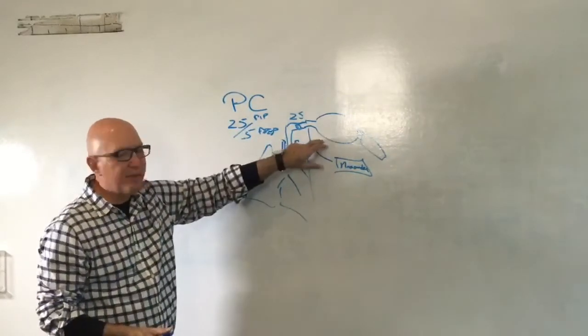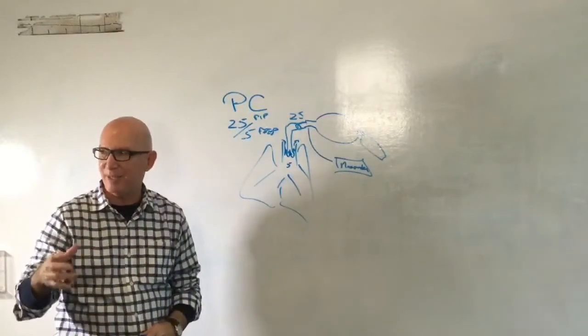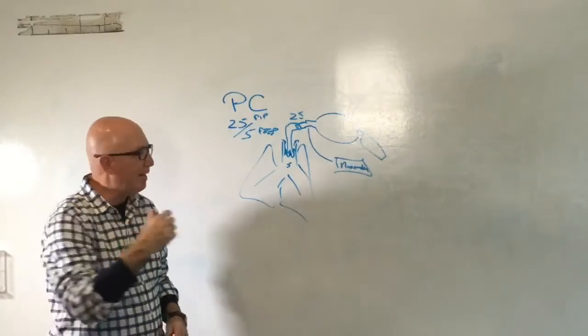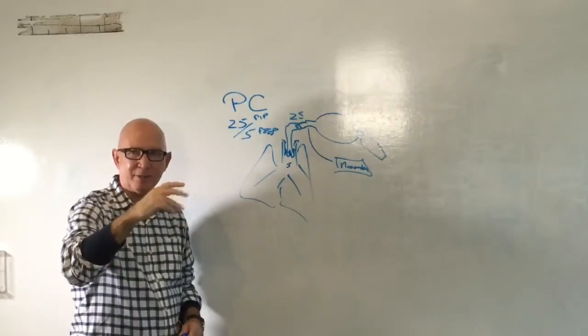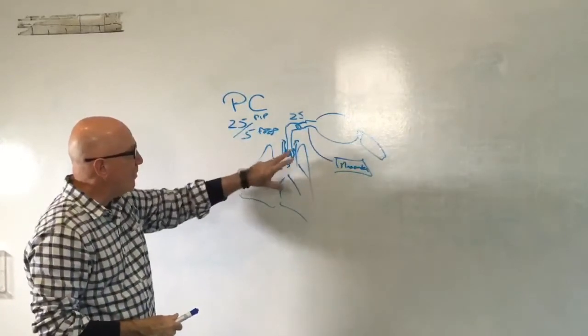In addition to that, it's very difficult for us to have the same inspiratory time on a consistent basis when you're squeezing a bag. You may think that you are, but you may not. And the way that we typically ventilate neonates is it's just a quick puff. So it's not a slow squeeze of the bag. It's a quick puff. So the pressure is being generated quickly. So there are a couple of things that I'm saying here.